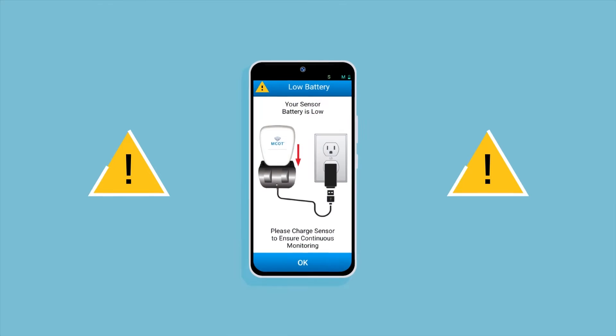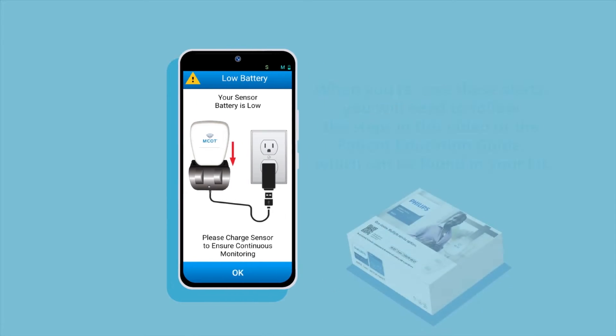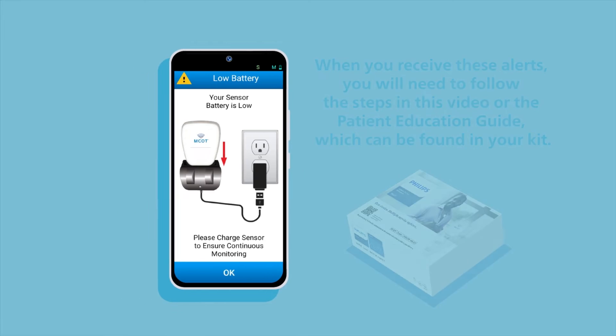While MCOT is designed to stay on your skin for up to five days, you will receive an alert on your monitor, which is the phone, when it is time to change the patch. You will also receive an alert when it is time to charge the sensor. When you receive these alerts, you will need to follow the steps in this video or the patient education guide, which can be found in your kit.